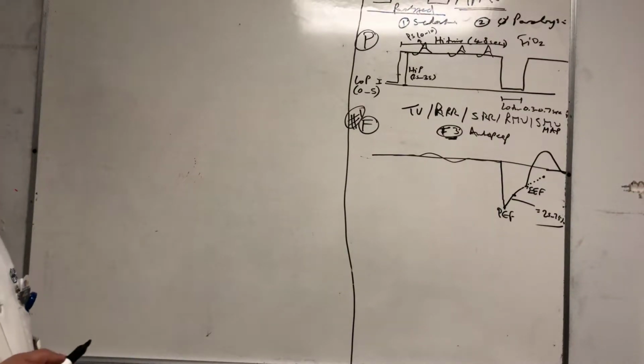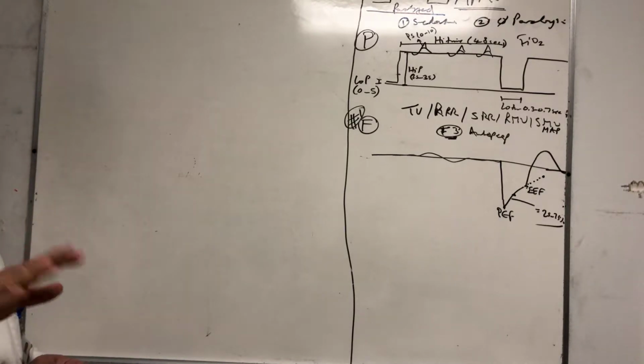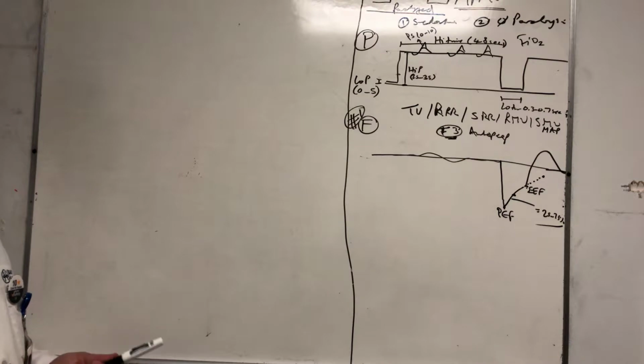And what you do is measure this ratio. So let's say in the morning you measure this ratio, and the ratio is 50%. Then you come back in the afternoon and measure it again without changing anything, and the ratio is now 60%. What is happening to the patient? Is this patient improving or worsening? This patient is improving, right?